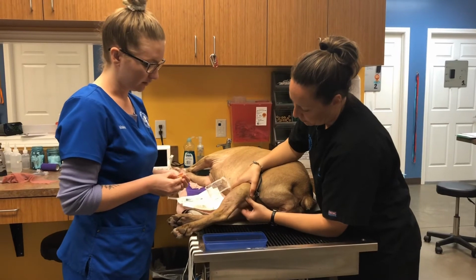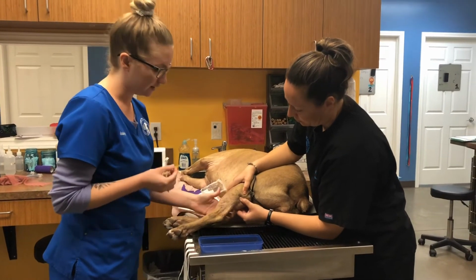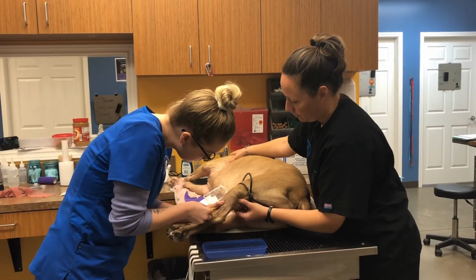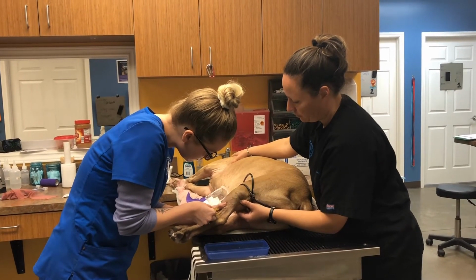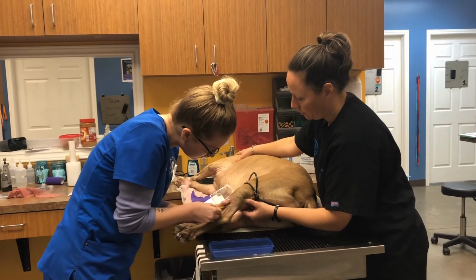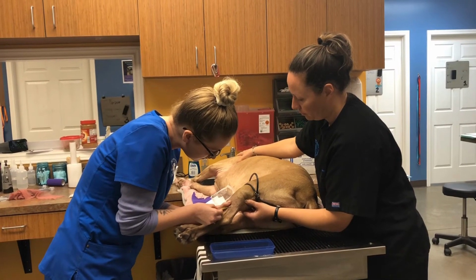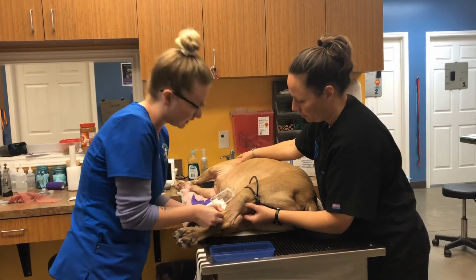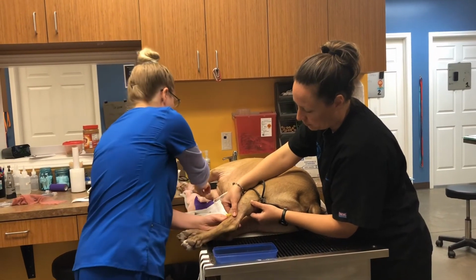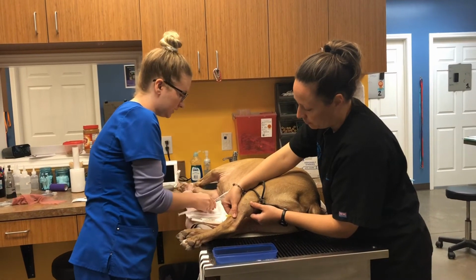Once I locate my vein, I'll insert the catheter bevel side up. Once I get a flash, I'll have my restrainer hold for me so the blood doesn't continue to flow, and then I will attach my T-set.